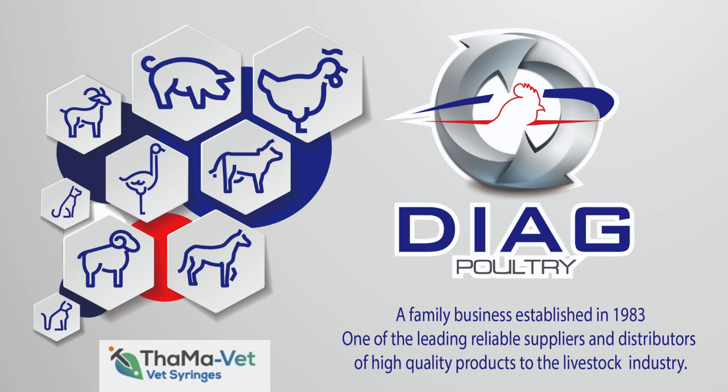Welcome to a video on how to prepare a ThaumaVet syringe for vaccination. It is very important to work sterile.